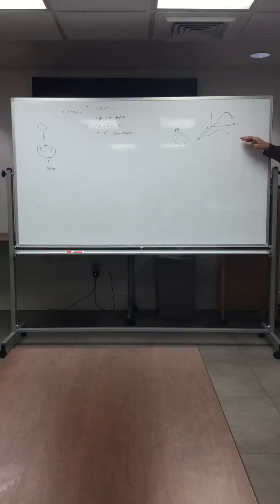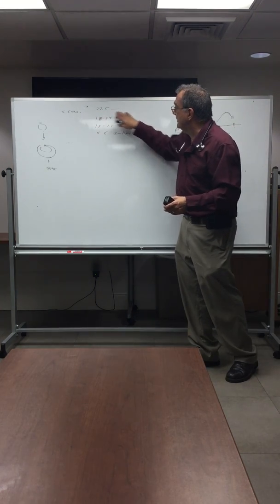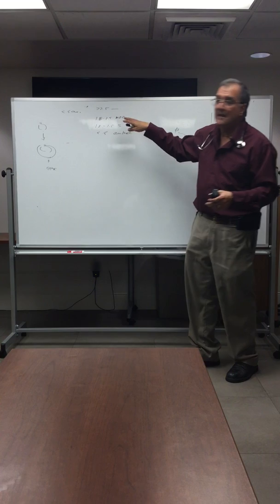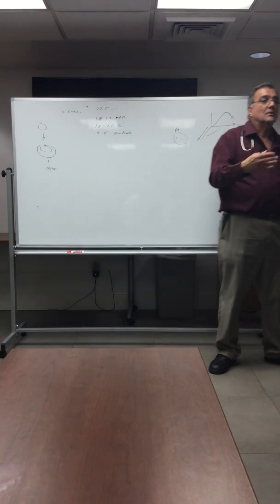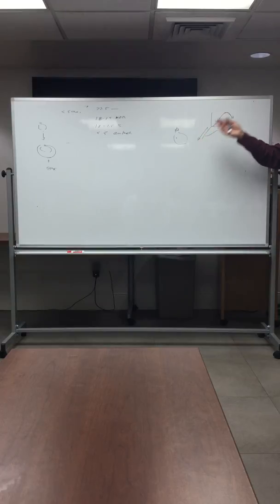So if you have aortic stenosis, this curve doesn't really start helping you too much because now you have a fixed obstruction. Mitral regurg is the other, and this is why we talked about the Bernoulli equation, because this valve area is determined by the echo. When we do the ultrasound, that's how we actually find the valve area, by the Bernoulli equation and the gradient. If you have a gradient that is more than 45, more than 50, you have severe aortic stenosis. Normal gradient is less than 16.